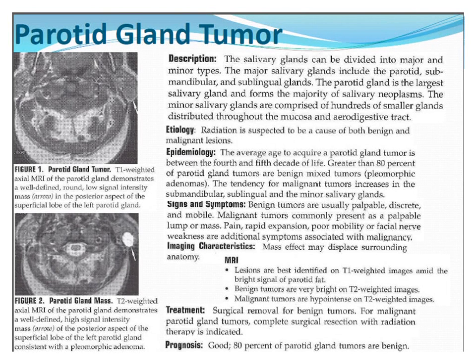They always just have to resect these. Sometimes we try to biopsy them ahead of time and get an idea of what it is, but many times they just surgically excise them and get the pathology from there, because even the benign ones will have a little bit of a low malignant potential, so you have to just take them out anyway. A lymph node, though, you wouldn't resect. So having the imaging in at least a couple different planes to look for that fatty hilum, the normal lymph node shape of a kidney bean, would be helpful.